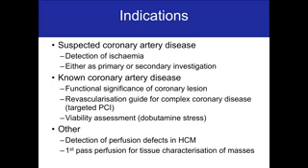There is another reason why in known coronary artery disease, you may want to do some CMR stress testing, and in this case we're talking about dobutamine CMR. If late gadolinium enhancement shows a 25 to 50%, or just around the 50% transmural extent, then these segments can recover with an intermediate probability.